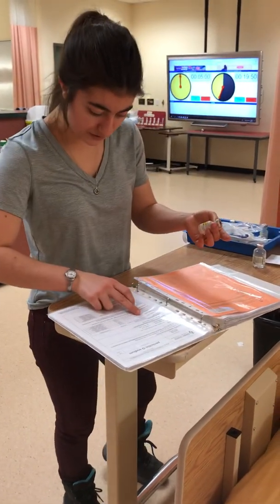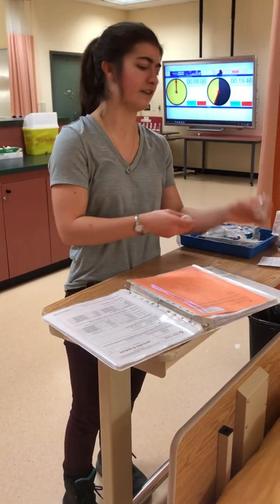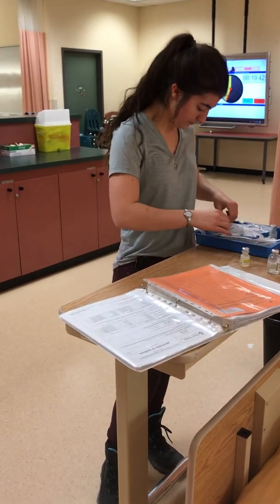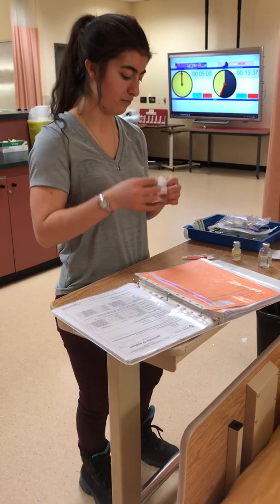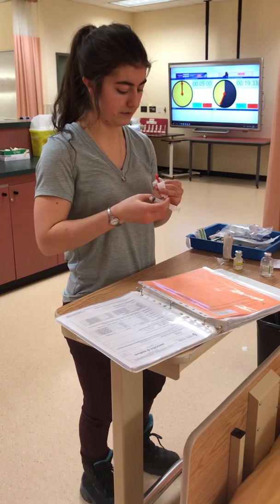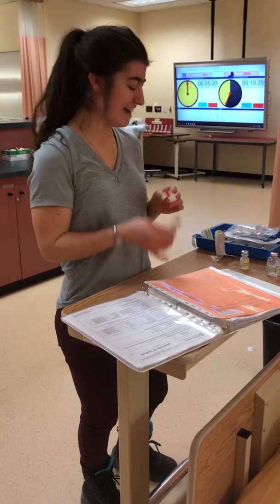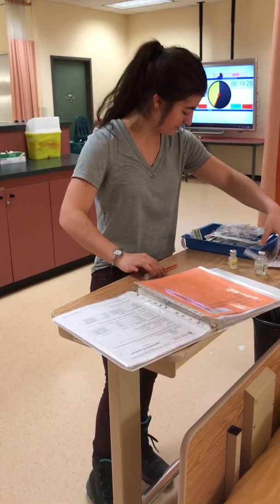I have picked my normal saline, not expired, also not expired. Alright, I'm going to be drawing up 3.1 mL. I have my blunt fill needle and my 5 mL syringe. I'm going to wing this one back. Take this and wing this one back as well. I'm not compromising the sterility of this. Sorry, I totally just touched it with my hand. I would grab a new one, and I'm going to put that on there. Now I have my syringe ready.